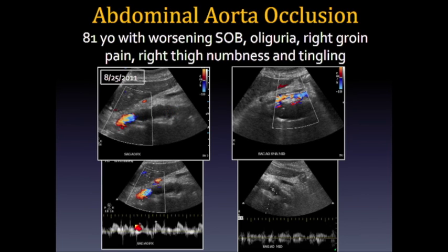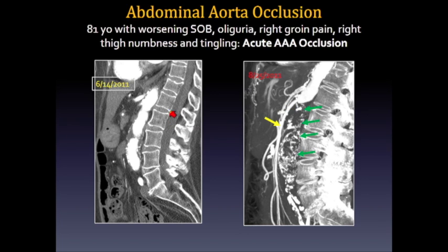And we put the spectral Doppler, and we saw very low amplitude waveforms, and this waveform is not really normal just because they hit the obstructive portion. And the only vessel that was helping this patient to preserve the organs and lower extremities was the SMA. And you could see it on the CTA that was done 2 months before.